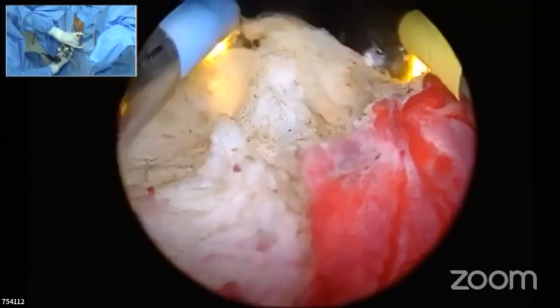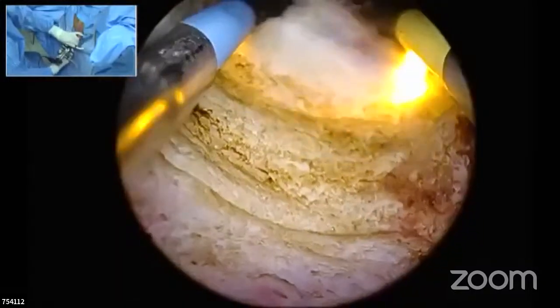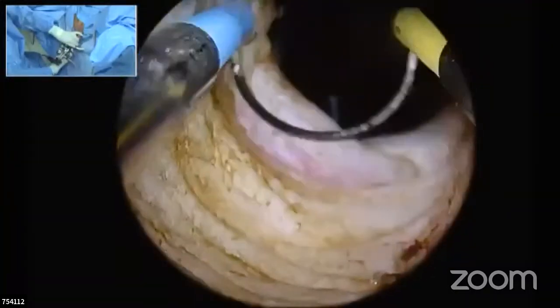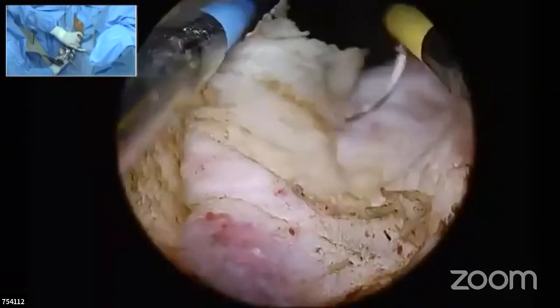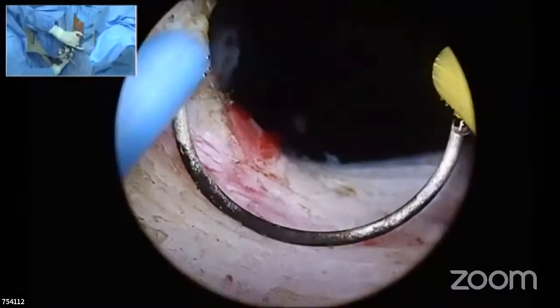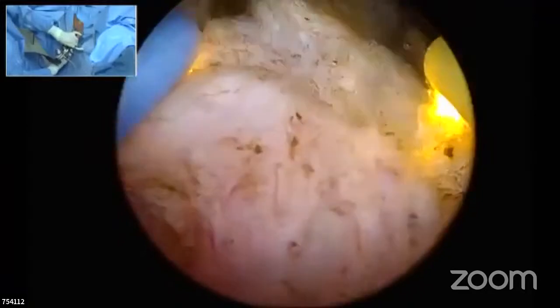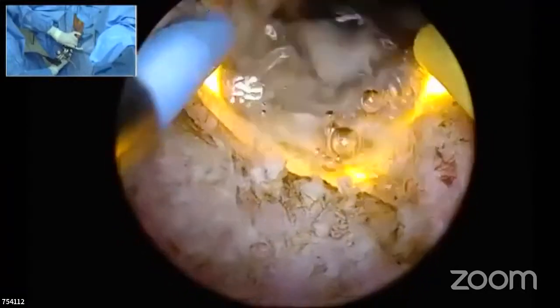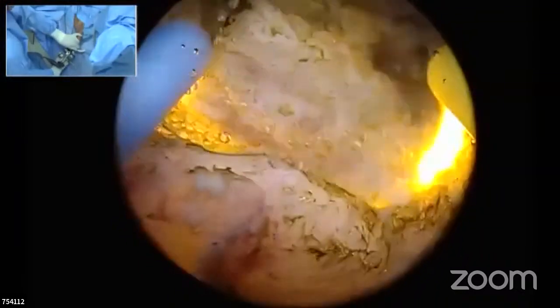Now I am going back to a Nesbit way of doing it on the right lobe. So I am taking the 11 o'clock position. I resect the tissue and reach the capsule directly. I think I've reached the bladder neck here completely. That vessel is there, and I need to reach the capsule here directly. Once I reach the capsule, I'll know the depth of how much I need to resect. I think I have almost reached it.